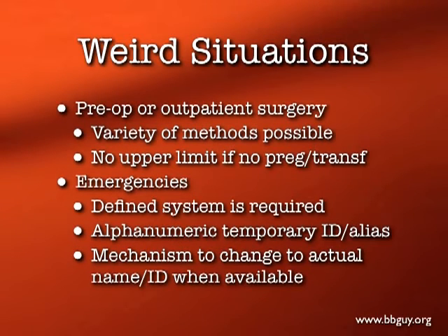So weird situations include pre-op or outpatient surgery, especially nowadays with patients coming into the hospital to get their blood work done and then not having surgery until the next day or the day after or a week later or 2 weeks later or whatever. There's a lot of different ways that we can figure out to try and utilize that same sample, and your handout talks about some of those. It includes making the patient just wear the blood bank wristband for 2 weeks or whatever.